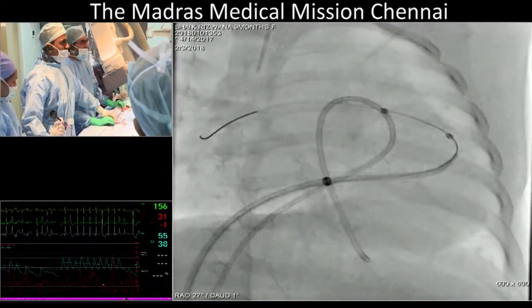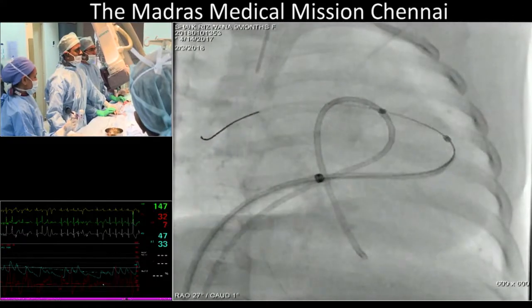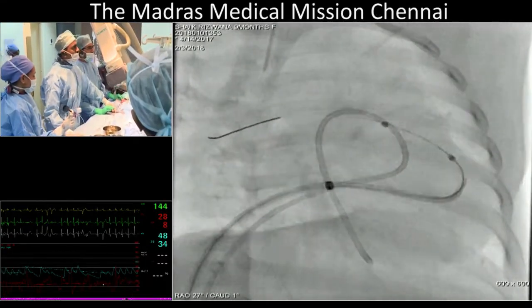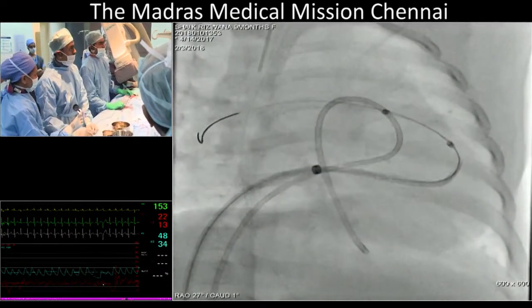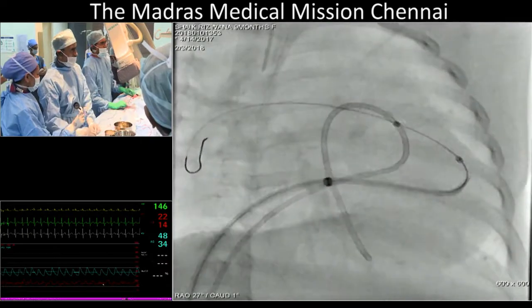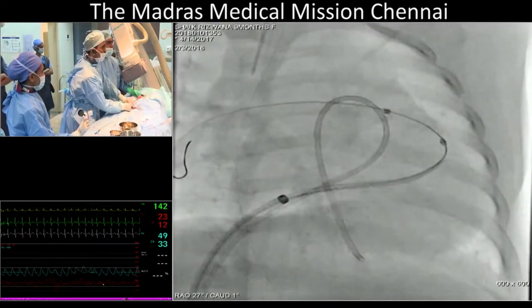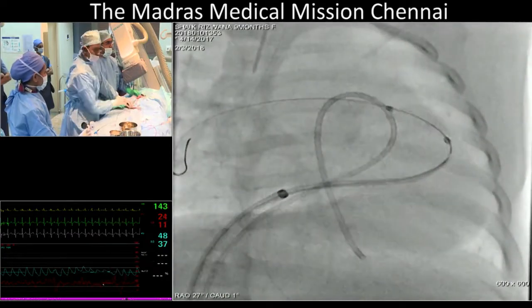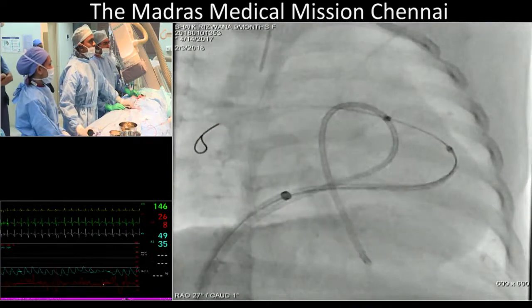Yeah, Boston Scientific. Now your other catheter's probably getting in the way, isn't it? Yeah, and what's that, Siva? Shiva, let us just go to Ho Chi Minh and join Tin, because he's ready for a very complex case. We'll come back to you after that. Sure. Okay, let's go to Tin.